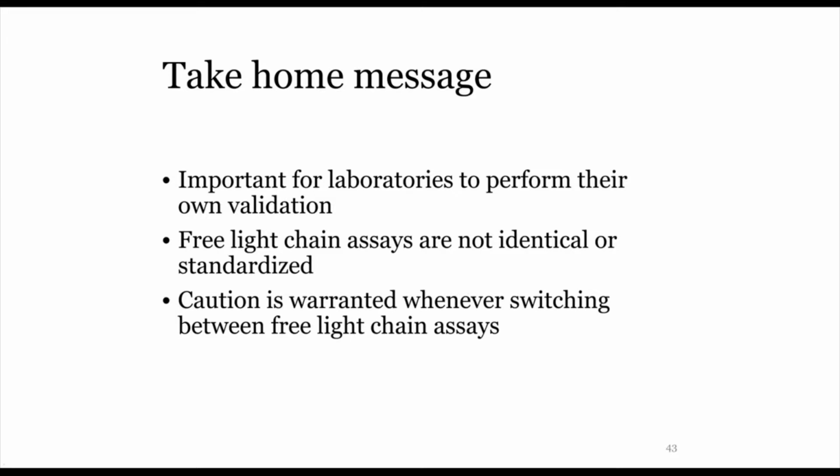But essentially, if the instrument gave an error, we probably should have done a manual dilution to determine that it was antigen excess. But if we were to guess, it probably is going to be an antigen excess, as we looked at the specimens that didn't give a numerical value, and that yielded a lot of high values for free light chains, especially for the lambda. So we do suspect that it might potentially be an antigen excess, yes.